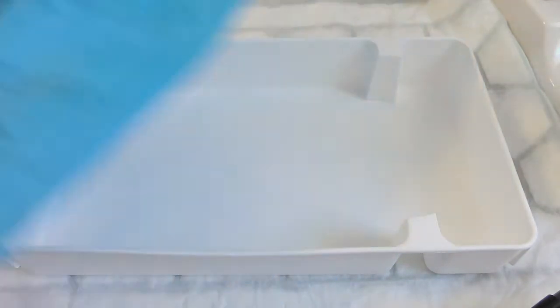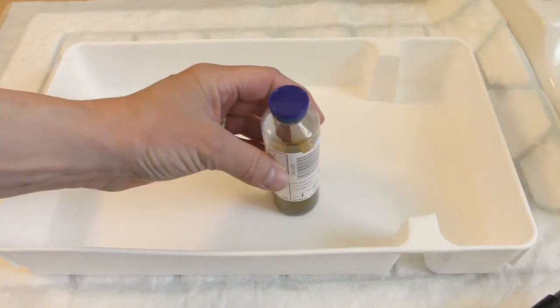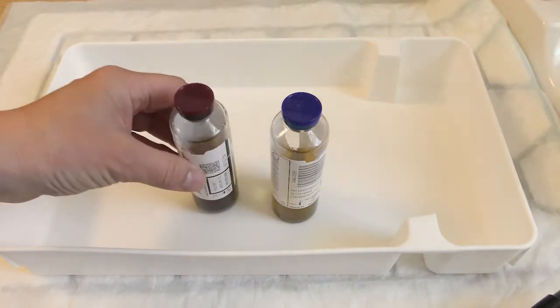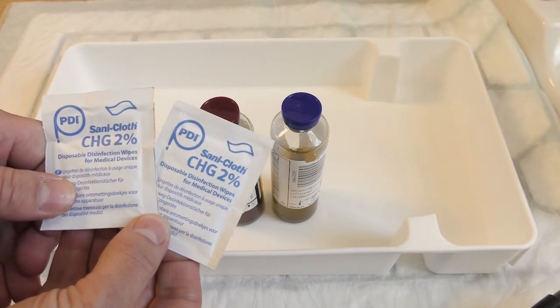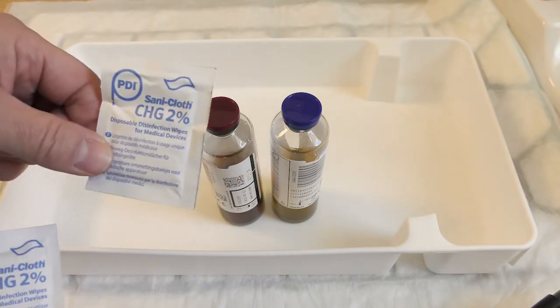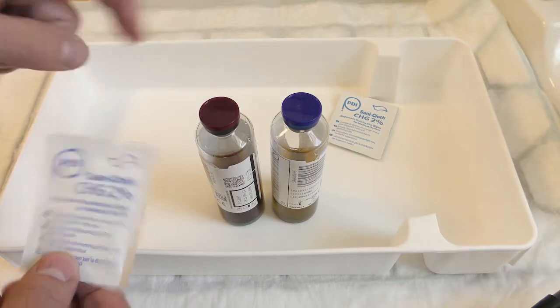In the blue blood culture bag there will be a blue aerobic bottle and a red anaerobic bottle. There will be two alcohol and chlorhexidine cleaning wipes. One is to clean the patient's skin, and the other one is to clean both of the bottle tops.